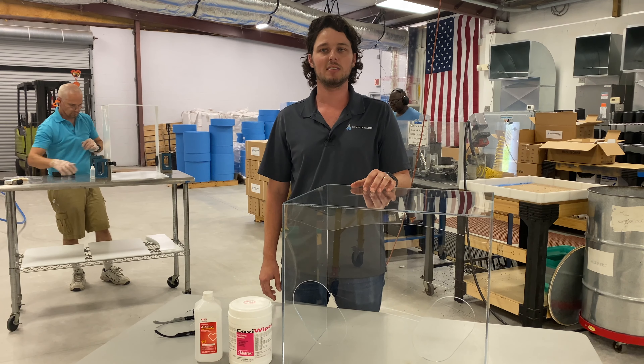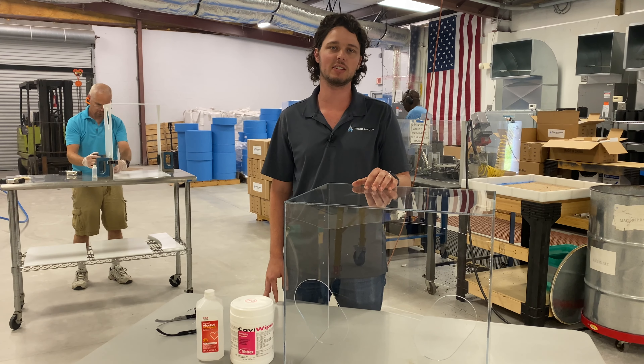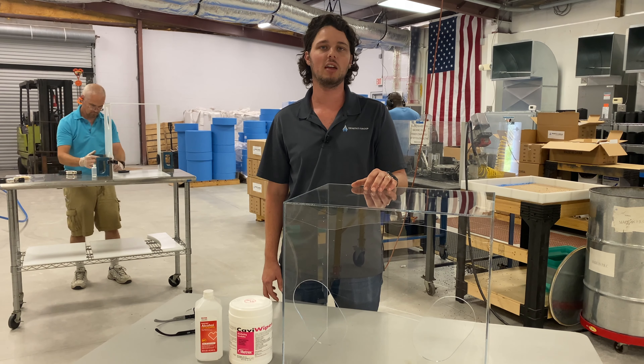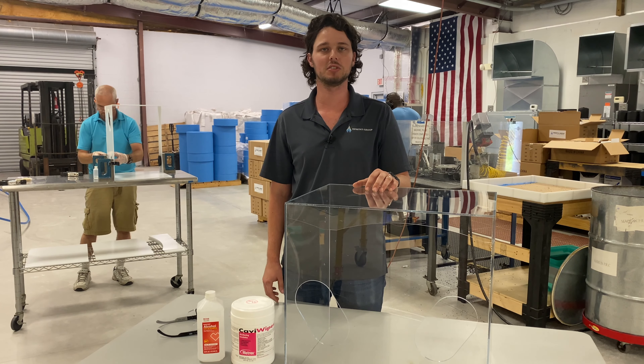During this process, it's necessary to intubate the patient. This procedure creates significant risk of passing germs through the air and via bodily fluids. The intubation box acts as a shield during this process.